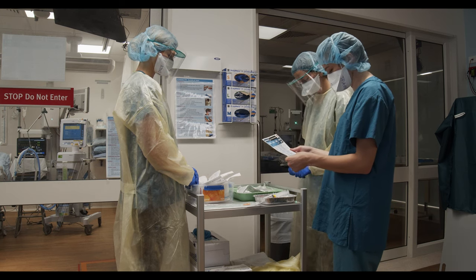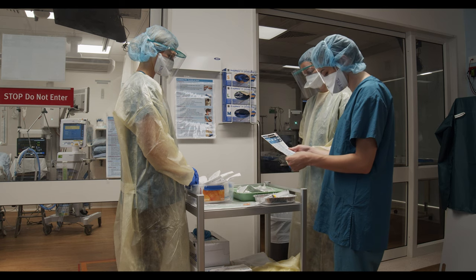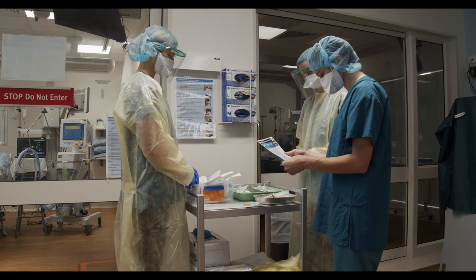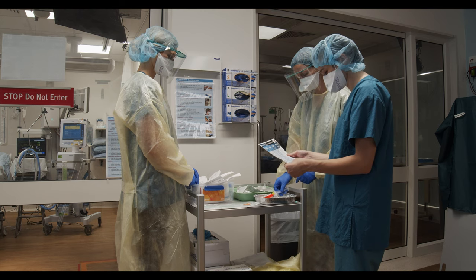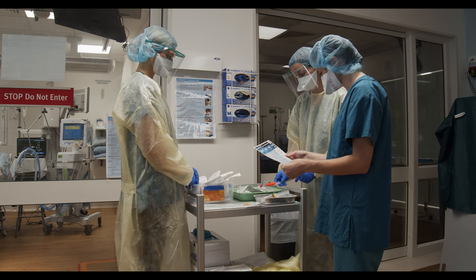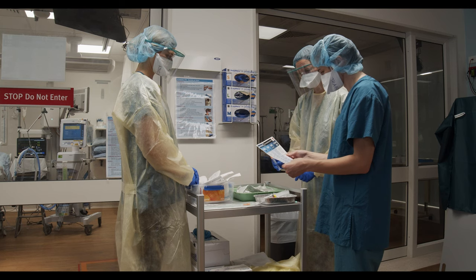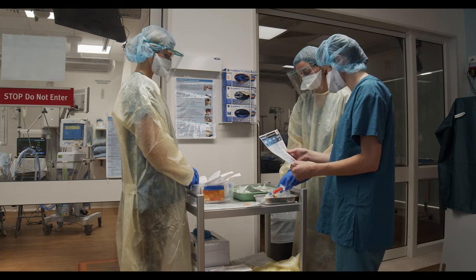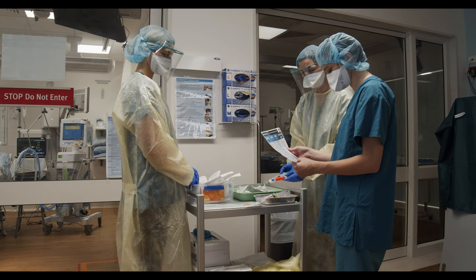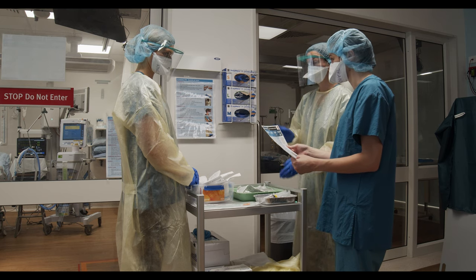It's also important at this stage to run through a drug check. Induction agent. So we've got ketamine, which is 2 per kilo, so 160 milligrams. Awesome, and muscle relaxant. Rocuronium, 1.2 per kilo, so we're going to use 100 milligrams. Awesome. For vasopressors. Got metaraminol and adrenaline. And then for post-intubation sedation. There's propofol drawn up. Awesome.